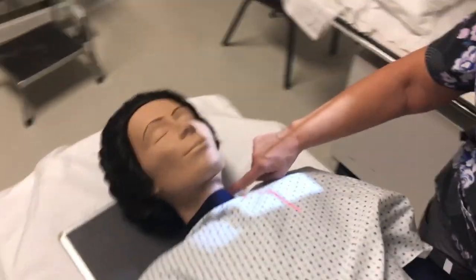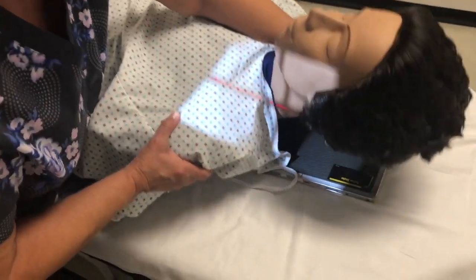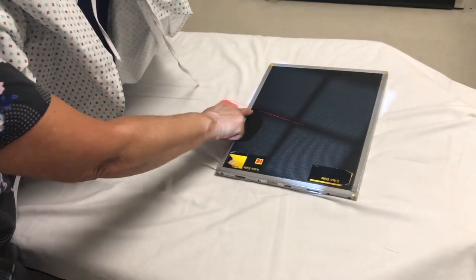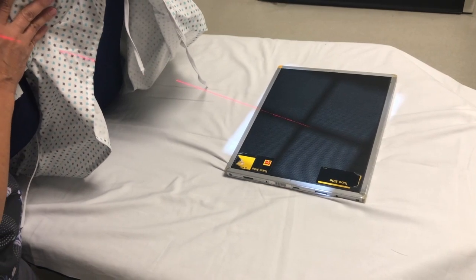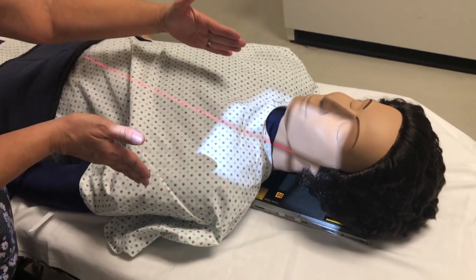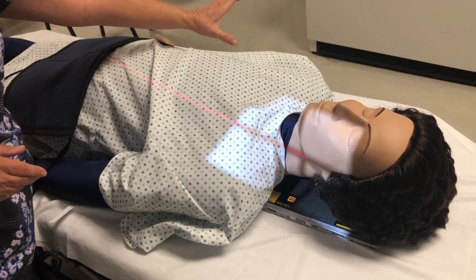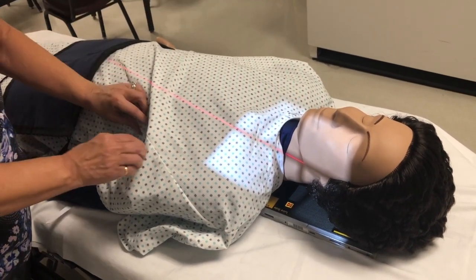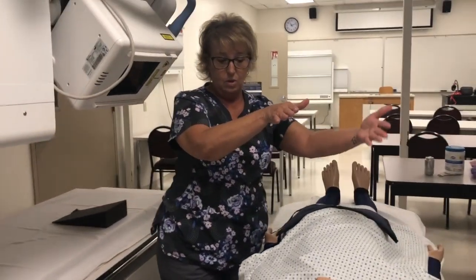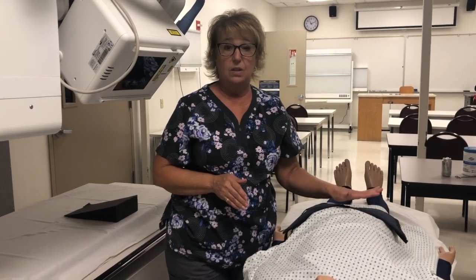Now, my central ray is entering here, and just for the sake of showing you where it's gonna exit, I'm gonna raise it up. And you can see that the laser now is more at the center of the IR. So that's why you have to offset it. If I had her centered on the IR, my projection would be on the right half and not centered. Okay, and then you would obviously go ahead and do the opposite direction. So that is how you do a trauma oblique.